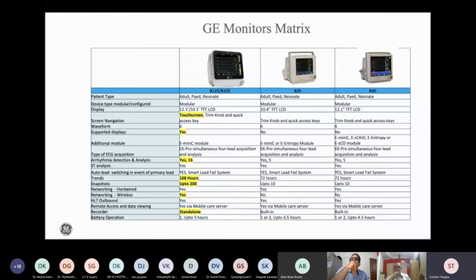All of them usually will come with a neonatal option, which I'll show you in some of the screenshots. How do you activate those options? There are two things in terms of input values. You can use a remote, you can use a touchscreen in some monitors, and in some other monitors, you can use a trim knob, which has been the input key for some time.